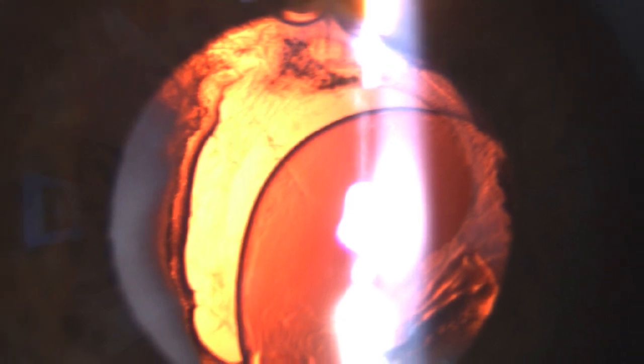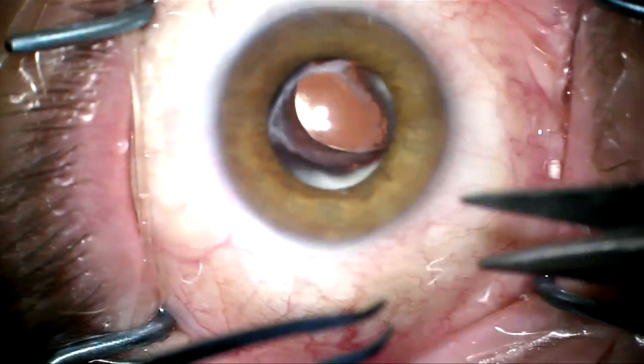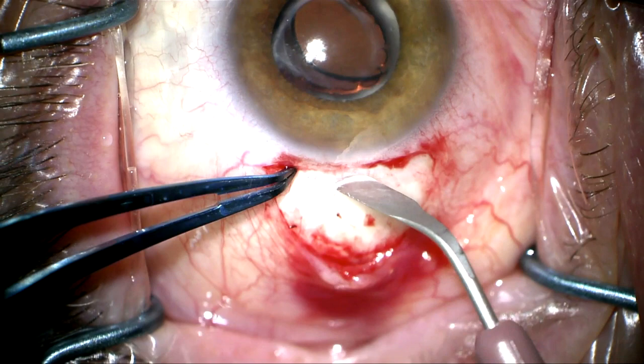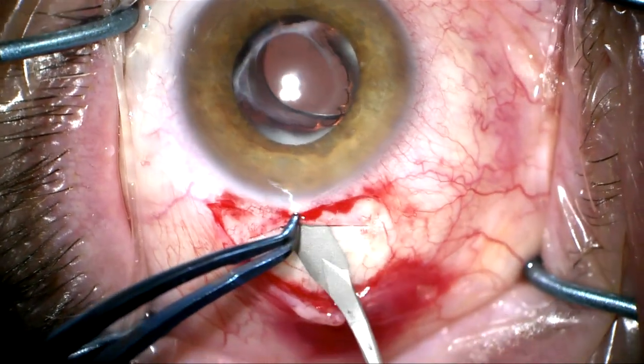This is a patient with a dislocated PMMA lens. It's behind the anterior and posterior capsule, which are fused together. There is a large Soemmering's ring embedded within that ring, which would be preventative of placing any kind of sulcus lens. The opening is too small for optic capture.